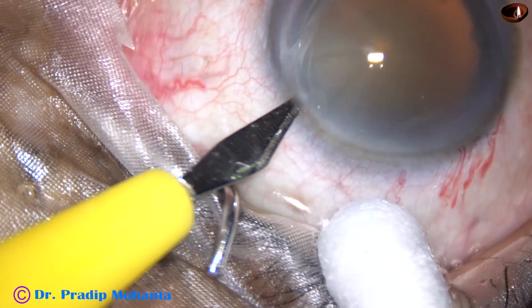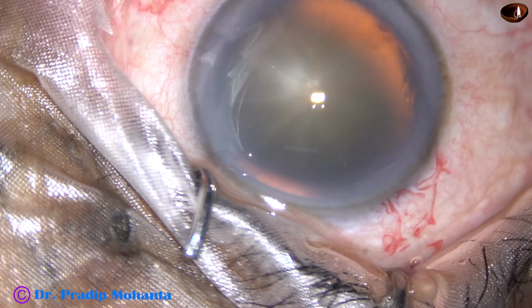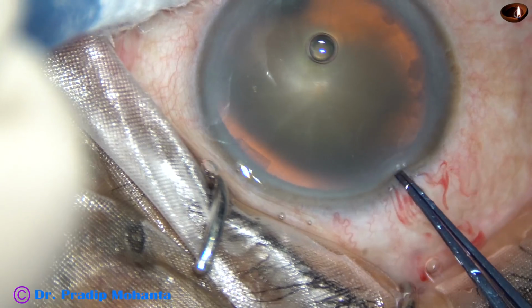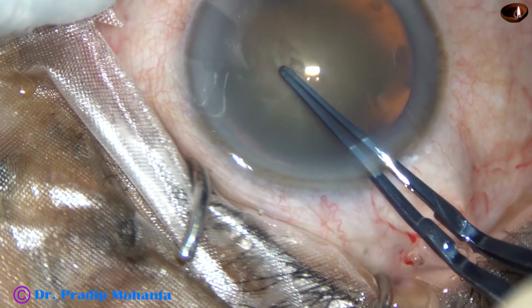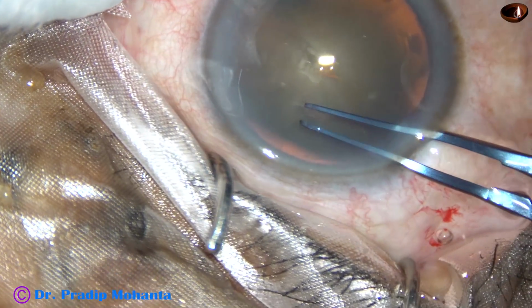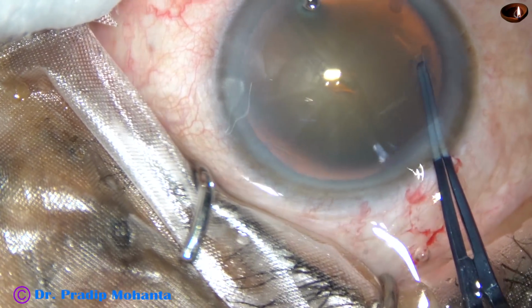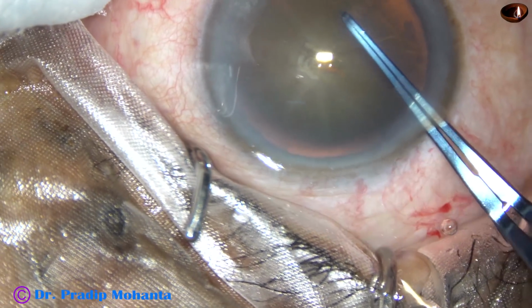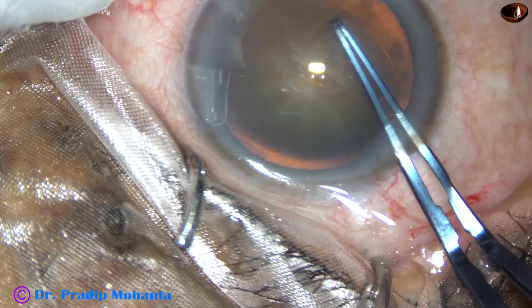The main incision has been made. This is a side port on the left side of the main incision, and now capsulorhexis is being done with the help of Utrata forceps. There was no problem in this step. Rhexis was adequate and it was fairly round.